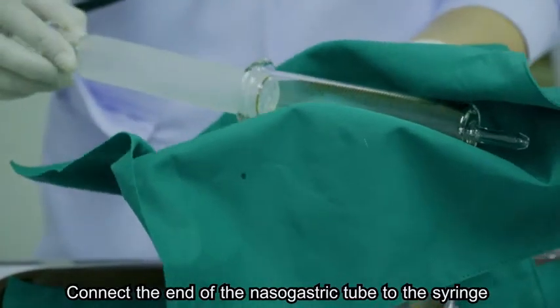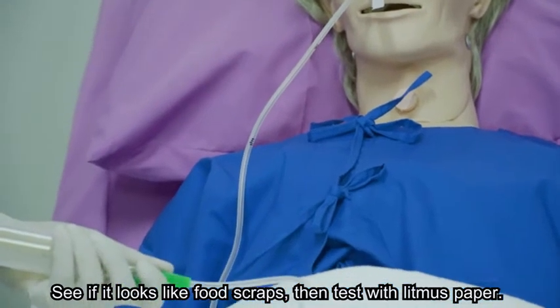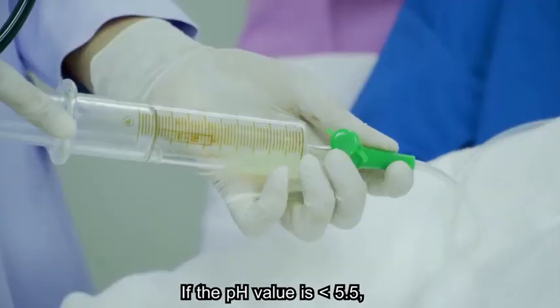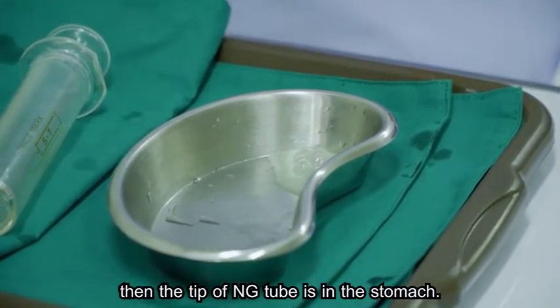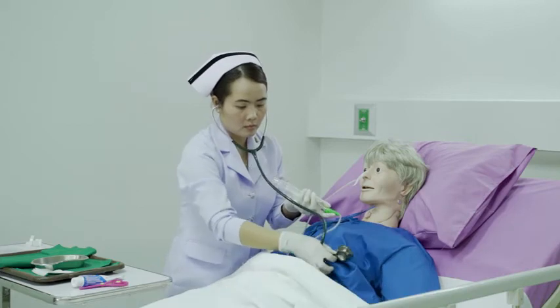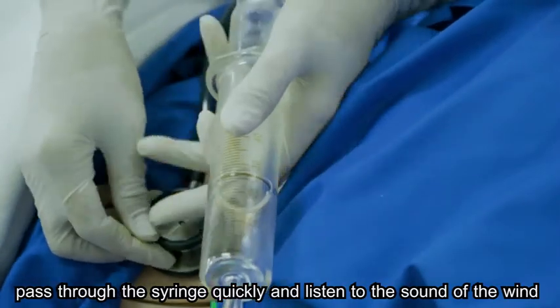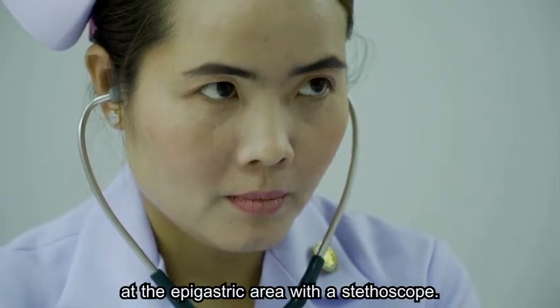Connect the end of the nasogastric tube to the syringe to draw the liquid out. See if it looks like food scraps. Then test with litmus paper. If the pH value is less than or equal to 5.5, then the tip of the NG tube is in the stomach. In case no food particles come out, push 20 to 30 milliliters of air into the nasogastric tube quickly, and listen for the sound of the air at the epigastric area with a stethoscope.